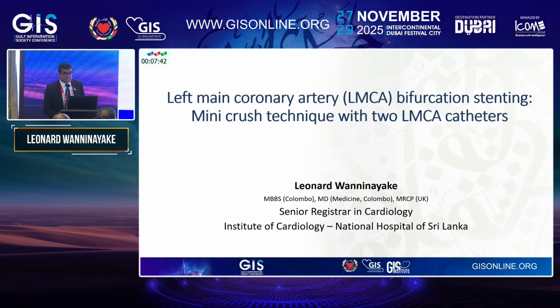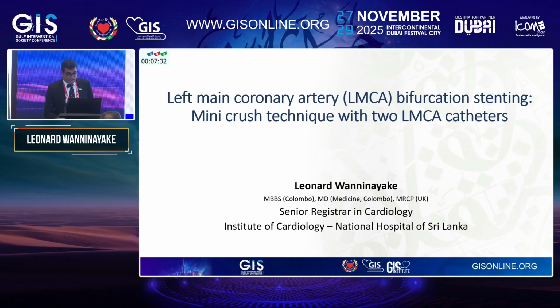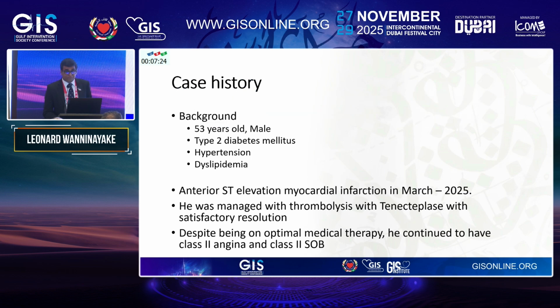So this is a case of a left main coronary artery bifurcation stenting with the mini crush technique, in which we had to engage the left main with two separate catheters. I'm a senior registrar in cardiology attached to the National Institute of Cardiology at the National Hospital of Sri Lanka, Colombo. It's a 53-year-old male patient with a history of diabetes, hypertension, and dyslipidemia.